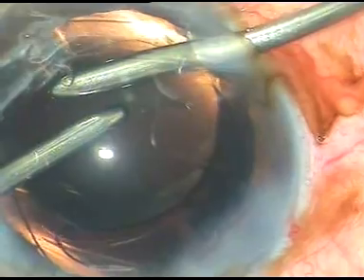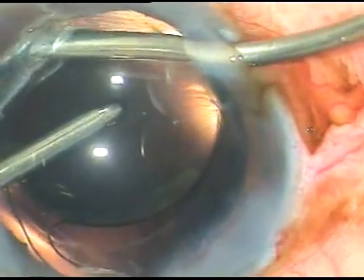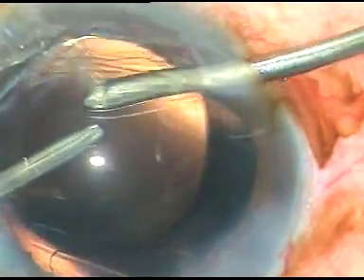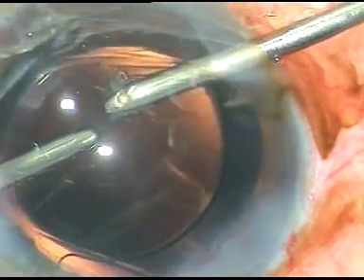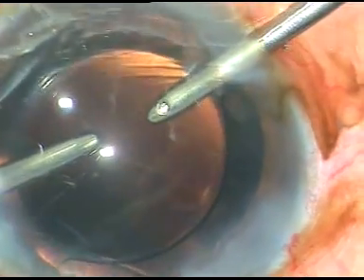When I aspirate this with bimanual IA, most of the cortical matter came out, but this is the vitreous strand which I must not pull.